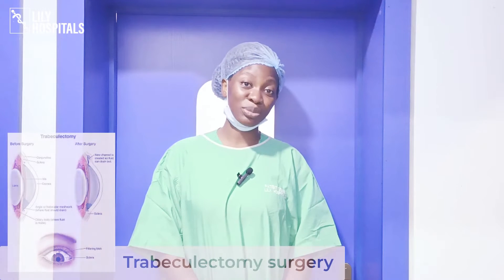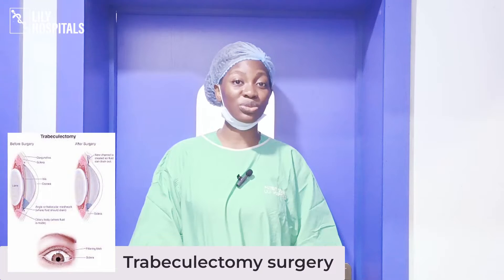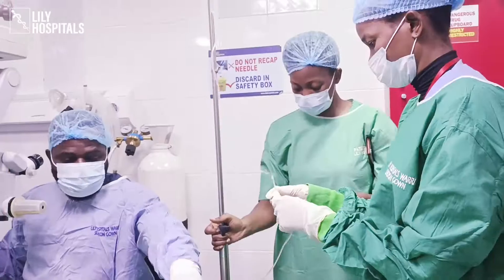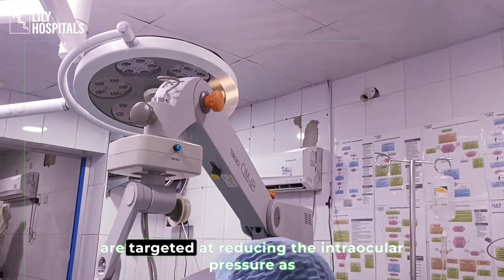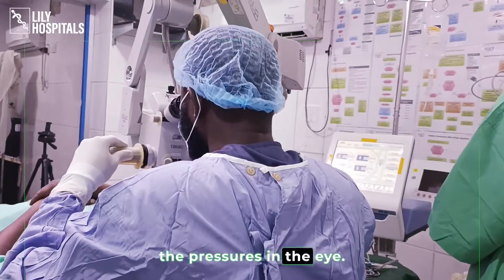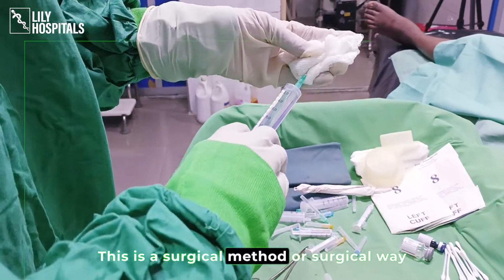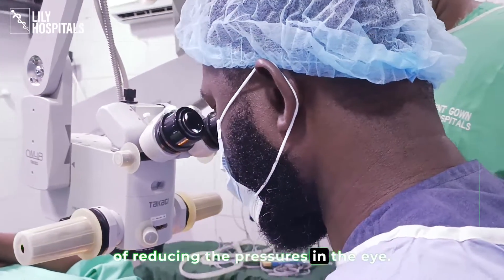Good morning. We're going to do a trabeculectomy this morning. It's one of the surgeries that we do for glaucoma. The modalities of treatment in glaucoma are targeted at reducing the intraocular pressures — the pressures in the eye. This is a surgical method of reducing the pressures in the eye.